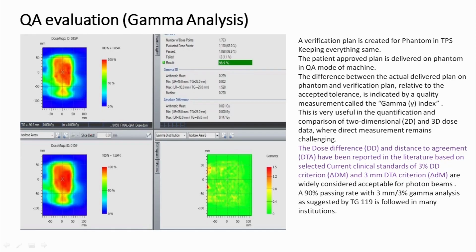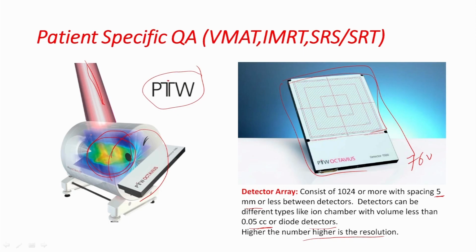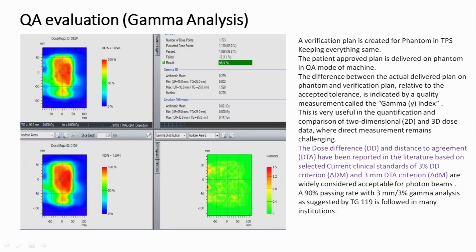It means that the dose will not be recorded for the patient, but it will be recorded for quality assurance purposes. You need to make a setup of the device on the couch of the gantry, and with proper setup of this phantom you need to deliver the plan, meaning switch on the beam, and the gantry will rotate and deliver a dose to this phantom. Once the phantom receives this dose, it will create a dose distribution.